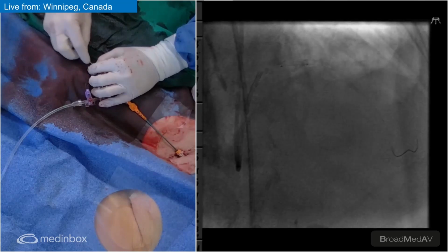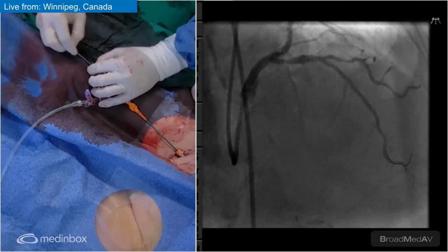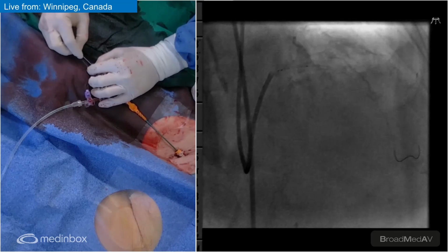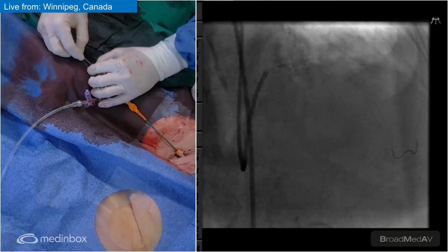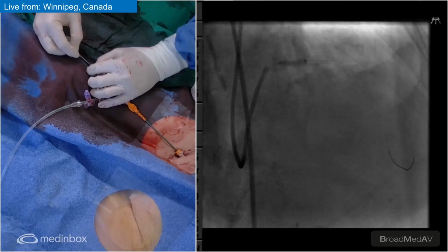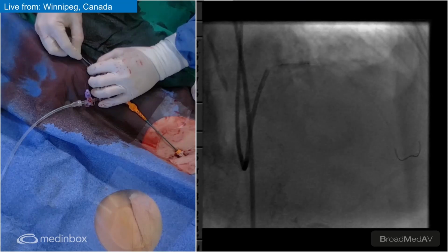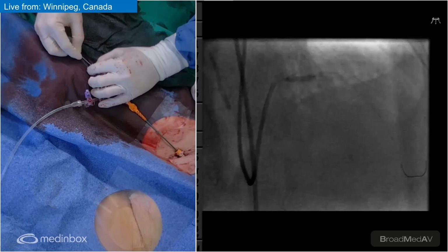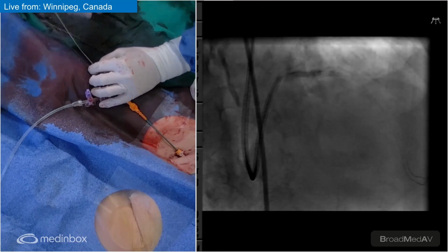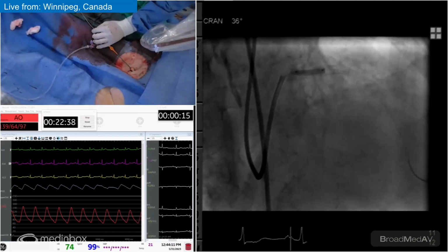A little puff there. Just want to make sure I'm going to hit it right at the spot. Come back a bit. Okay, let's go. Let's do it. Up. Let's go to 12, 14. That looks well expanded. Just get a zoom in on there. And down, 14. I think it's a bit constrained there. What do you think?